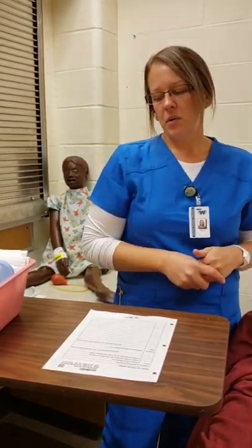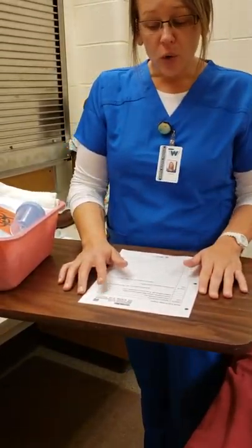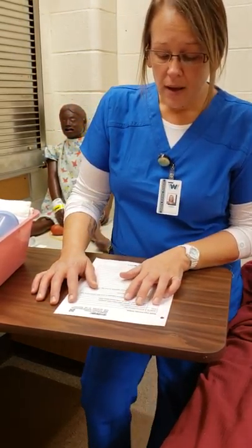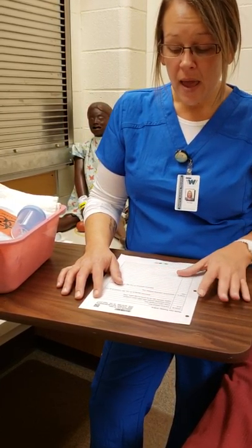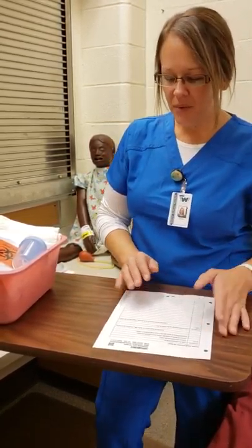Hi, I'm Toni Bova and I am a nursing student here at Williston State College. Today I'm going to be performing midstream urine collection and an indwelling catheter insertion and removal. I'm going to start by performing hand hygiene, either outside my patient's room or in the med room, and I'm going to check the order from the doctor.